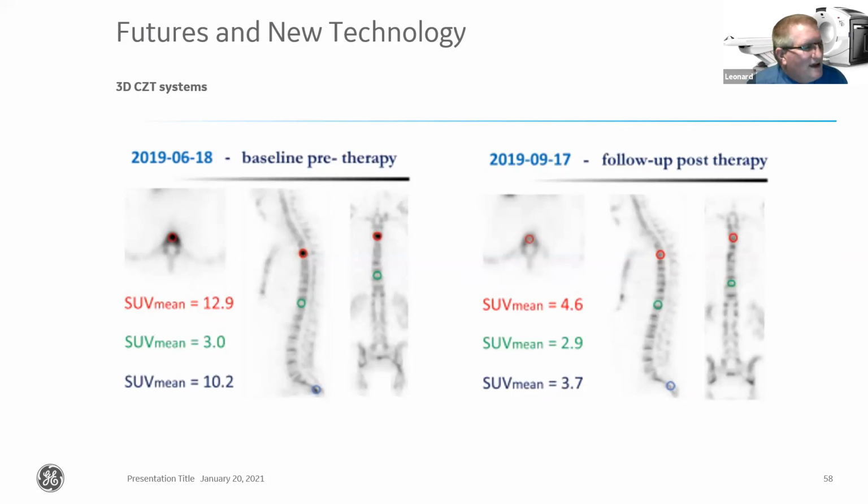So we're trying to now gauge, not just from previous positions where we started in nuclear medicine, looking at providing some treatment by putting a source close to a patient and then seeing what happened. And it was very, very high dose, so it damaged tissues. Going forwards to starting some of the basic imaging, we've gone through to make sure we can map and correct for the attenuation of the rays within the body by doing some of the CT input, utilizing that CT then to do a diagnostic CT to provide us with fusion imaging.